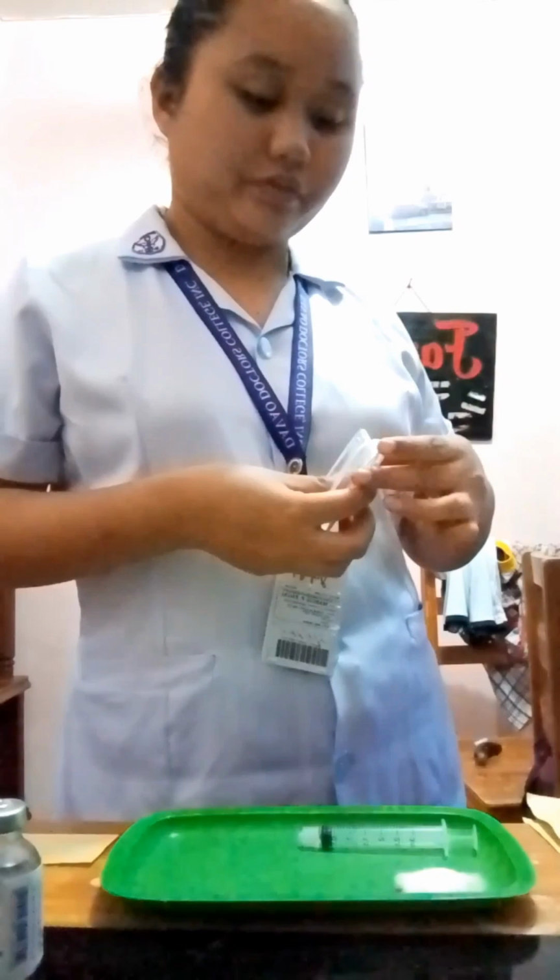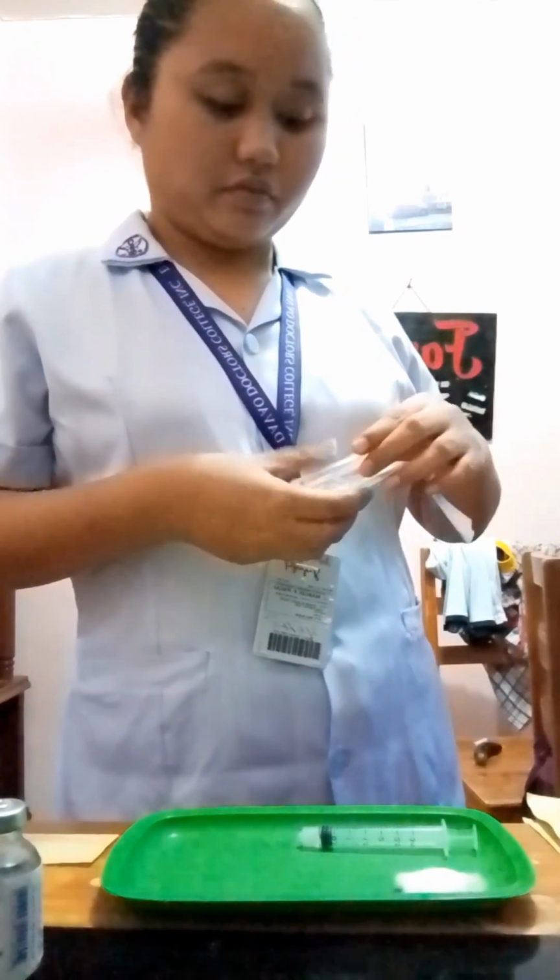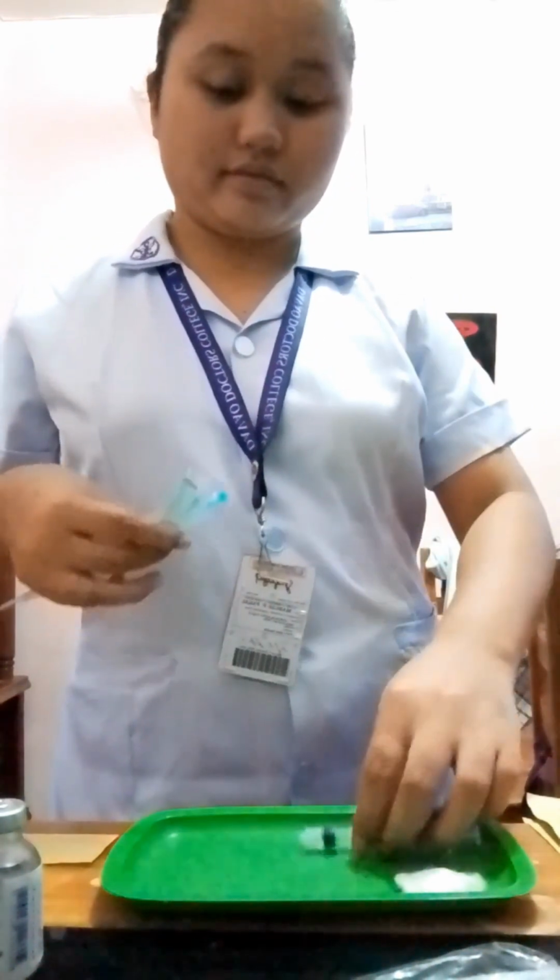Now I am going to get the aspirating needle, so we can draw the medication.